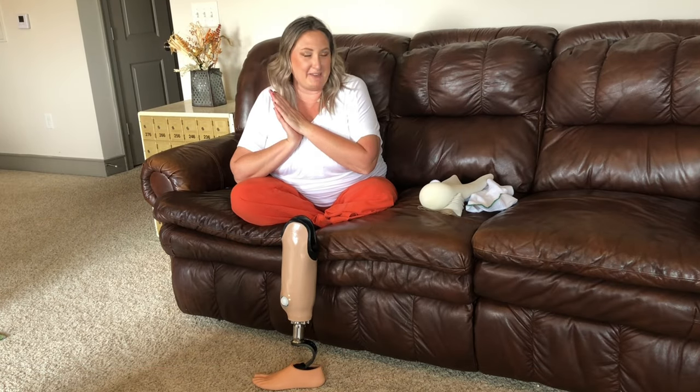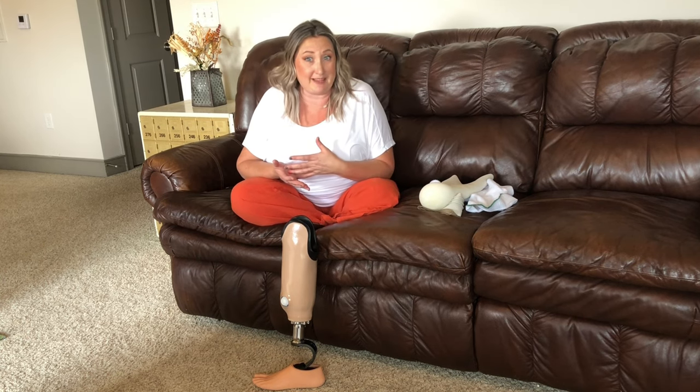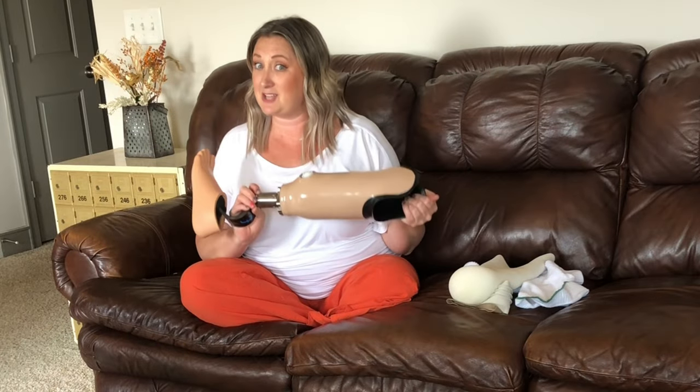Hey everybody, my name is Kari. If we haven't met yet, I am a below the knee amputee on my left leg, and I have been that way for 15 months. Today, I'm going to be talking about sockets.